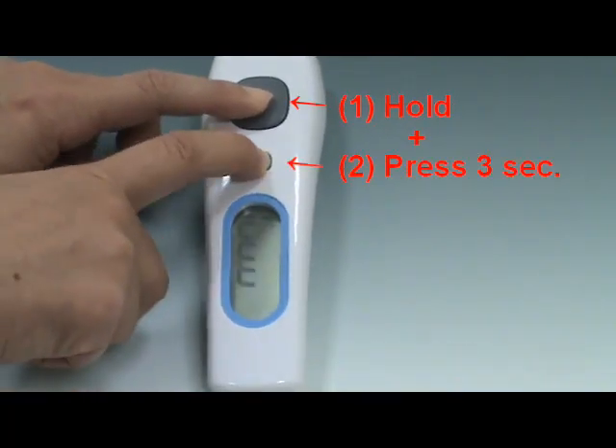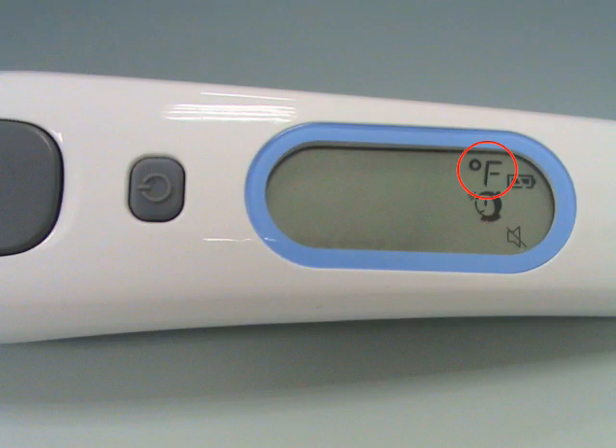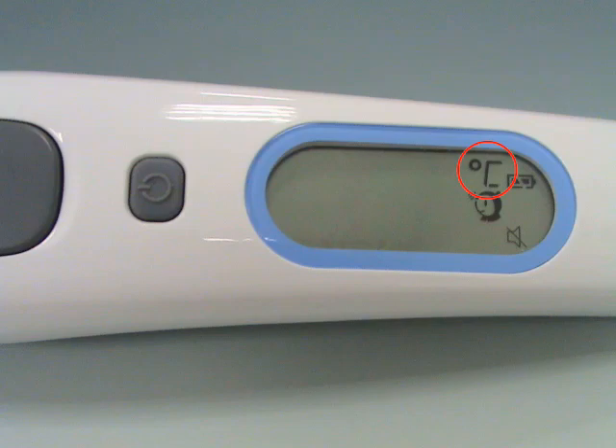In power off mode, press and hold the stop button, then press the main button for 3 seconds. The mute icon will flash on, and the icon will switch from degrees Celsius to degrees Fahrenheit. You can use the same process to switch the display back from degrees Fahrenheit to degrees Celsius.